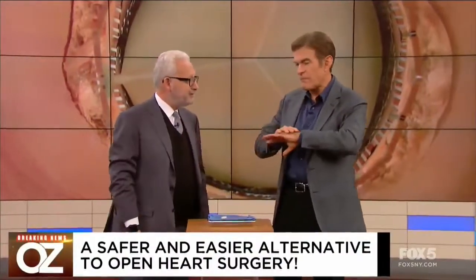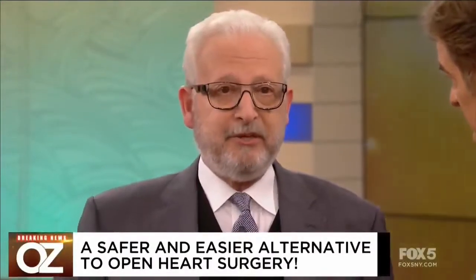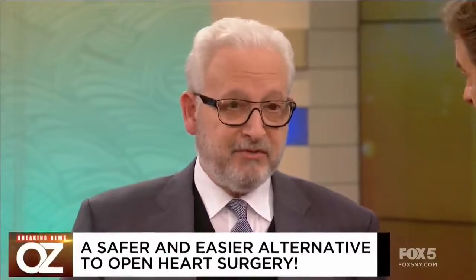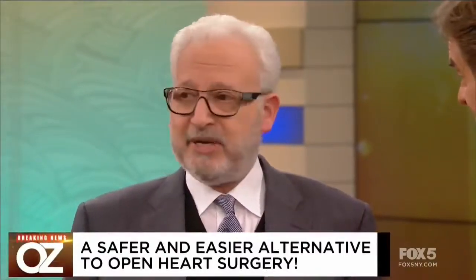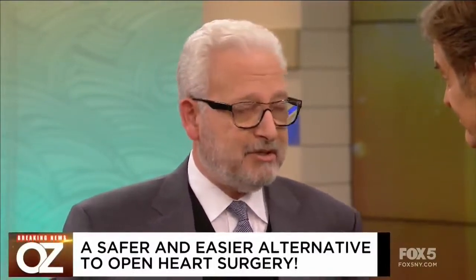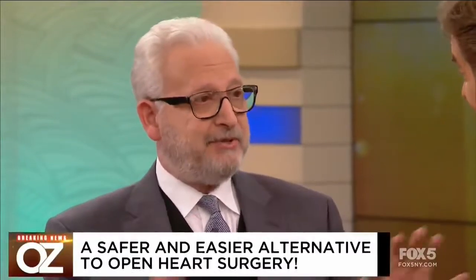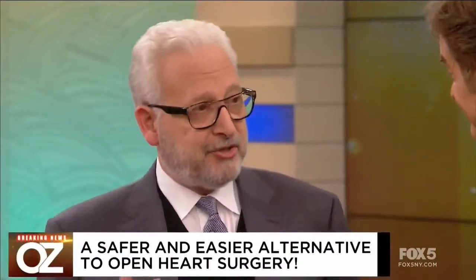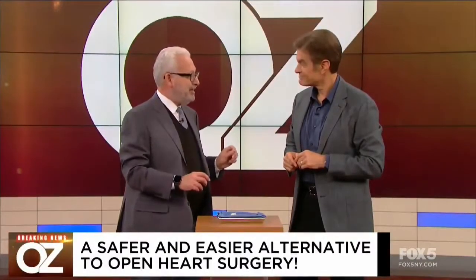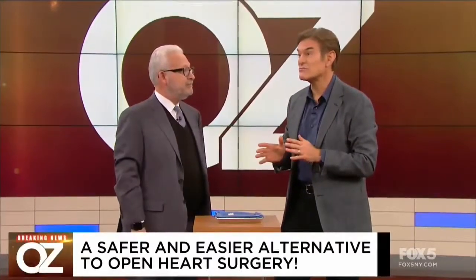This was front page news everywhere around the world. So this device, this technique, was originally going to be used only for the patients who were very high risk for surgery. What we did was now the 5th randomized trial, but it's in low surgical risk patients, which is the majority of patients with aortic stenosis. What we learned was that after a year of following these patients, there's 1,000 patients in this clinical trial, you compare surgery versus TAVR, we learned that there was about a 50% reduction in death, stroke, and rehospitalization at the end of a year if you use the catheter system, the less invasive system.